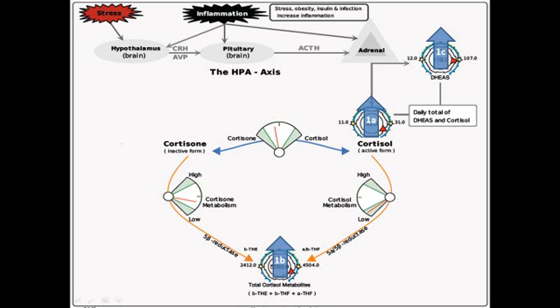But what we find is when there's increased stress that becomes chronic, then we start to influence some of these other parameters, so the body's going to start to metabolize that cortisol in a way that's going to get rid of some of it so that you can decrease that excess cortisol. Oftentimes we'll start to see a preference for cortisone, which is the inactive form of cortisol, to again try to rid the body of that excess cortisol. As well, you'll see cortisone and cortisol metabolism increase to try to clear some of that excess cortisol, and then you end up with a pattern where the cortisol metabolites are actually elevated to a greater degree than is cortisol as your body begins processing this chronically elevated cortisol.